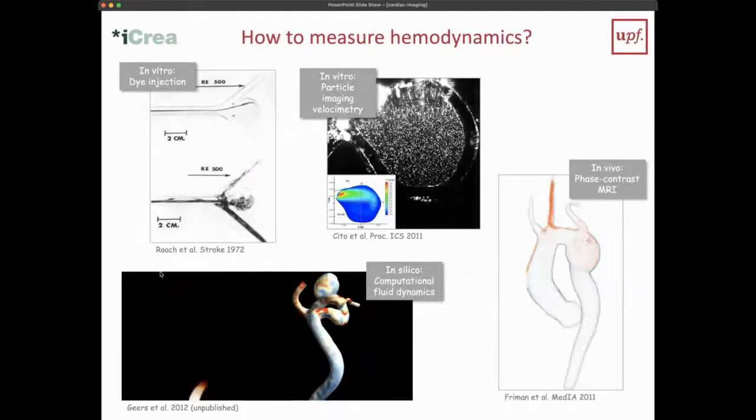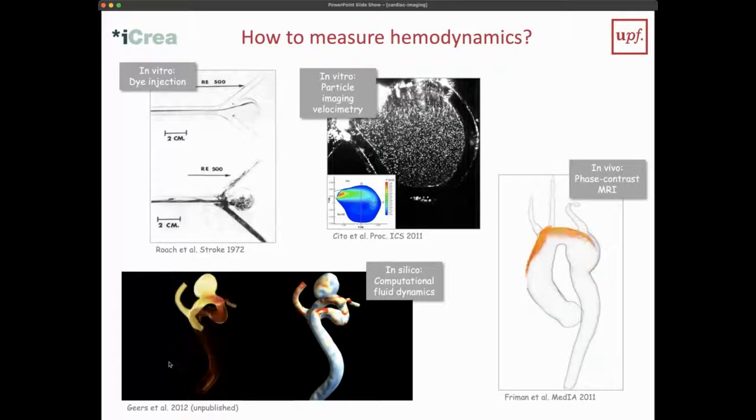Okay, another way that we also said when we look at MRI images is that with MRI, we can actually also measure velocities. So by doing phase contrast MRI in this case, or doing perfusion diffusion imaging, we can really look at blood flows. And that is actually quite relevant in cardiology, or in cardiovascular applications.